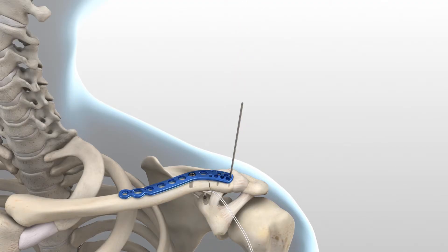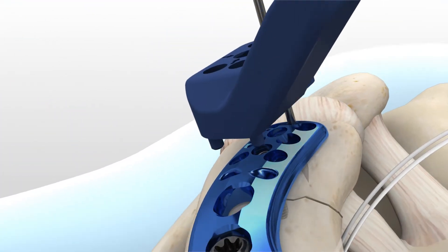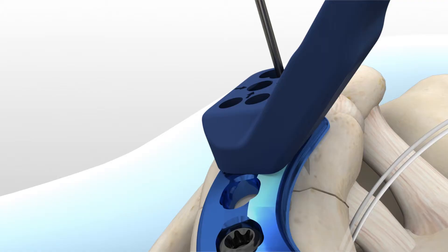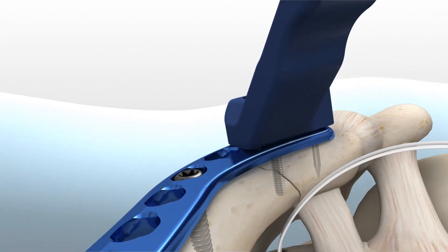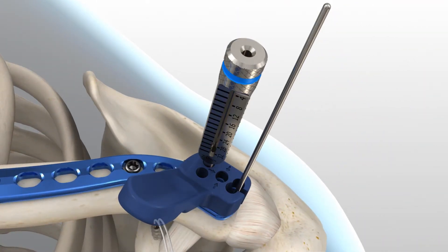The targeting guides are color-coded — blue and green — to match the corresponding left (blue) and right (green) plates. Slide the targeting guide over the K-wire and down onto the plate. The correct positioning of the targeting guide is achieved when the two pins on the bottom surface of the targeting guide engage the two suture holes just proximal to the distal screw holes. For the remaining distal locking holes, place the 2.0 mm locking drill guide through the targeting guide and into the desired hole. This will hold the targeting guide flush to the plate.